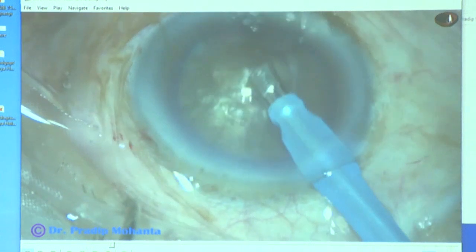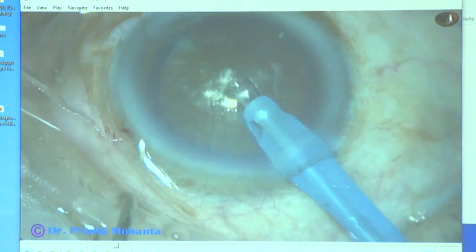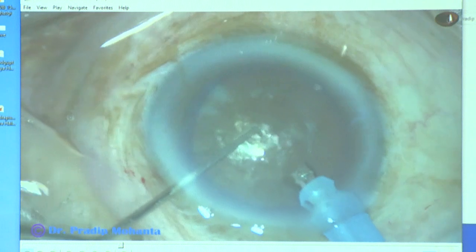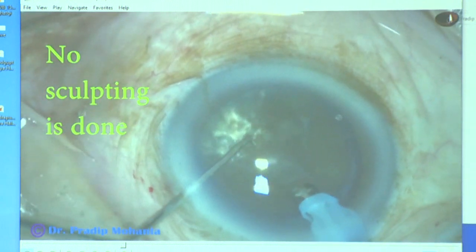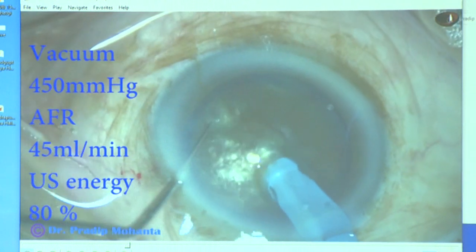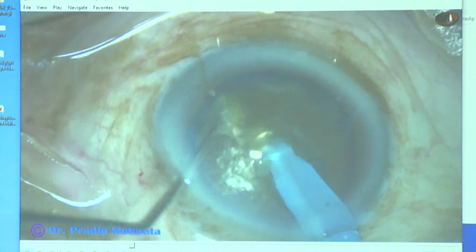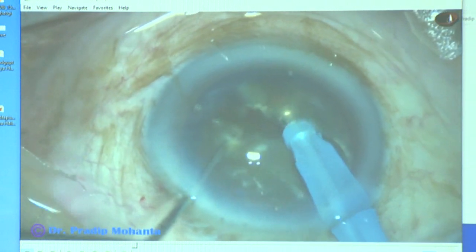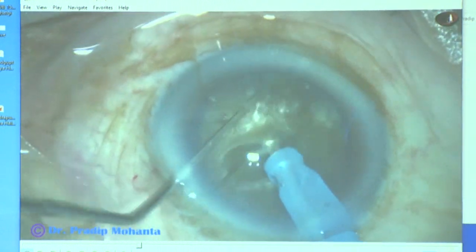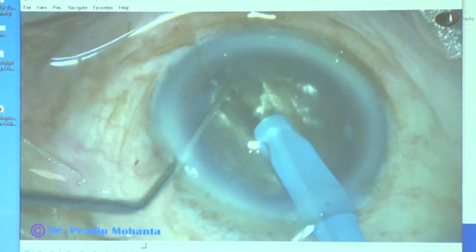And now the phaco needle goes in, some superficial lens matter is removed. I see the exposed part of the tip, it is a little more than other routine cases. Now, no sculpting is done. Bury the tip just in front of the main incision, and it goes through the substance of the nucleus at a deeper plane under the surface, like a submarine goes underwater. That's why I have given the name submarine chop. Get a good crack. Don't do a lot of lateral separation. Come to the other side, rotating 180 degrees.